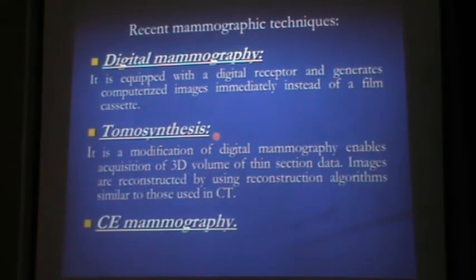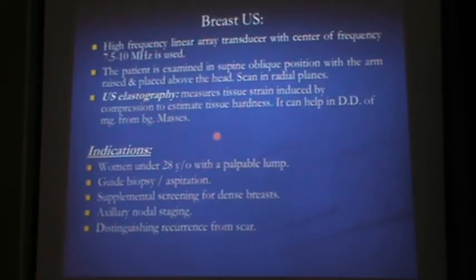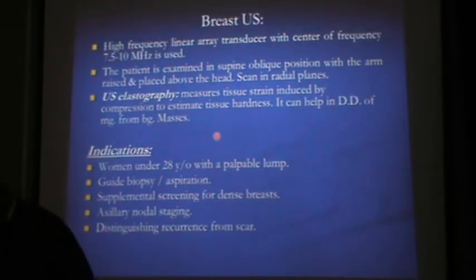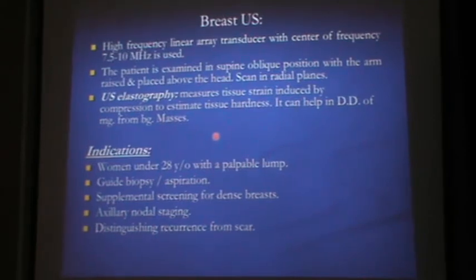Recent mammographic techniques are digital mammography, tomosynthesis, and contrast enhanced mammography. Breast ultrasound, just a brief talk. Mona will talk in detail about the ultrasound.